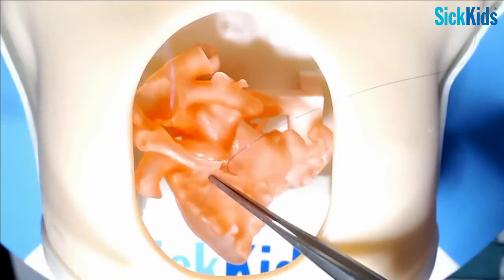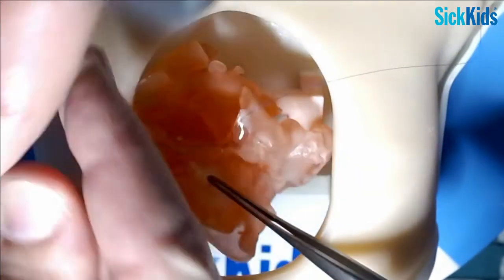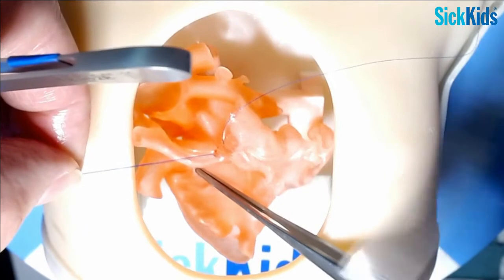So I'm going to, just for sake of brevity, tie this. I do tend to tie these, but I'm going to cheat and not tie it the way we normally would. Okay, cut that.